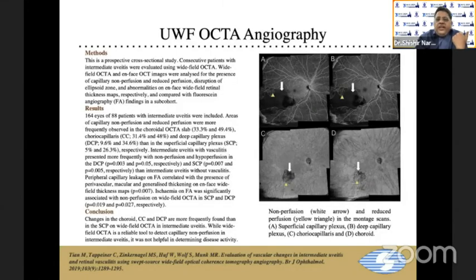Then ultra-wide field angiography is now being done as an OCTA as well, and you can see that in retinal vasculitis you can do a montage imaging, and you can have a really good picture of what is happening in retinal vasculitis as well.